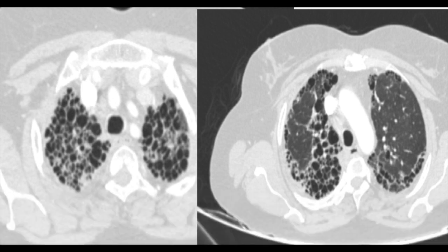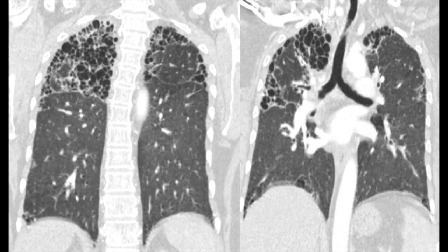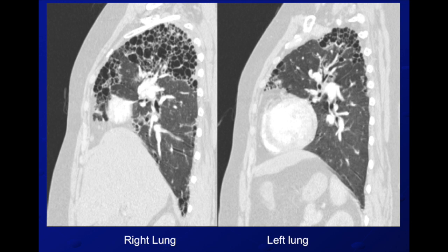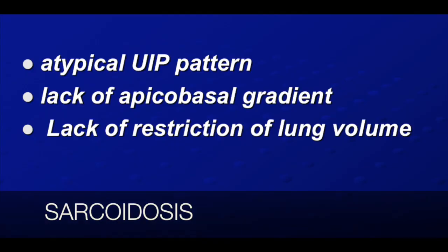In this next case: there are apical honeycombing, interlobular septal thickening, and loss of architecture especially in the upper lobe. There is not much basal involvement. This coronal image shows bilateral honeycombing predominantly in the upper lobes with lesser changes in the lower lobes. This is an atypical UIP pattern — you do not call this IPF, you call it UIP atypical, because it is not involving the bases. This turned out to be stage 4 sarcoid.